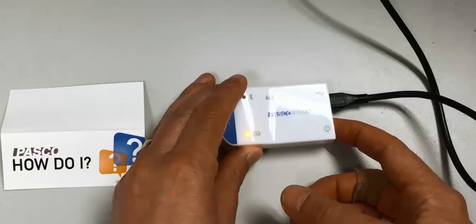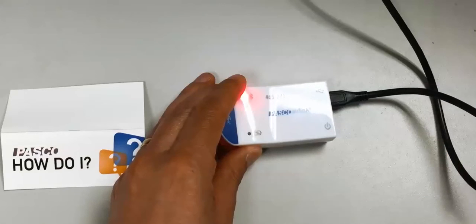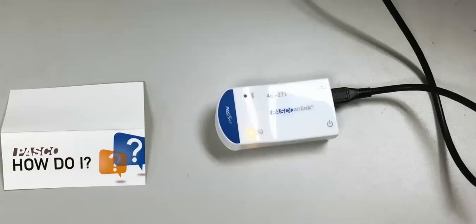Once you've held the power button, you'll see the light turn out on the lower left hand side. That means the unit has reset itself, and then you'll see the flashing of the Bluetooth light on the upper left hand side.